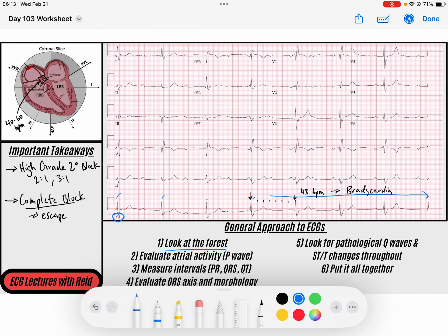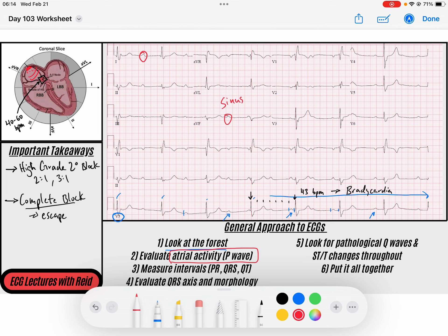Looking at the QRS complexes - I see P waves, there seem to be some P waves here, but if you notice the PR interval of these P waves seems to change. Look at this PR interval versus this one versus this one. So let's evaluate the P waves. What is my atria doing? The P waves are upright in lead one and upright in AVF, so that tells me these are sinus P waves. Let's see how my AV node is handling those P waves.